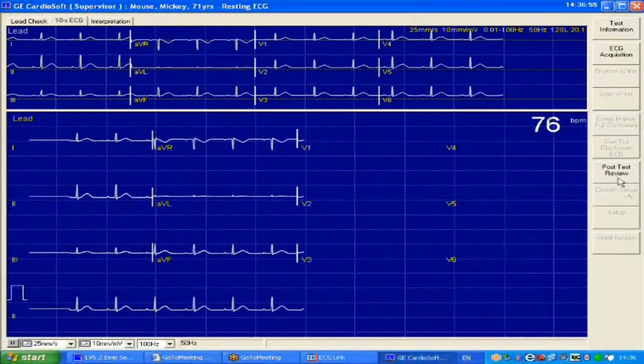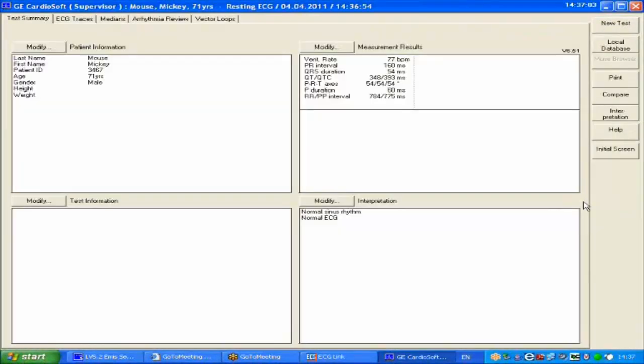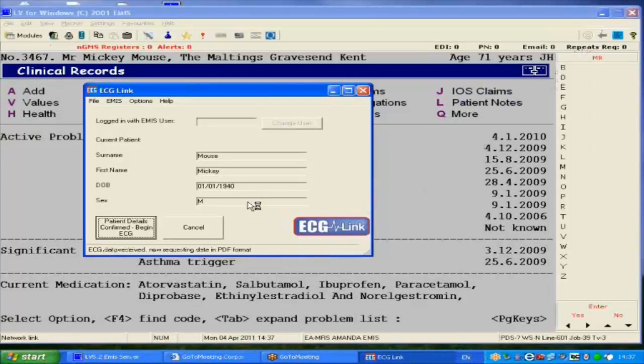We can then go to the post-test review. You can see some of the results in this window, and there are also other features available here. However, we normally want to get the ECG onto the record immediately, so press the close window button. The ECG report is created as a PDF, which can then be placed onto the record.